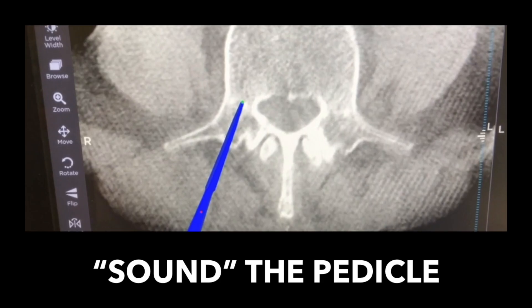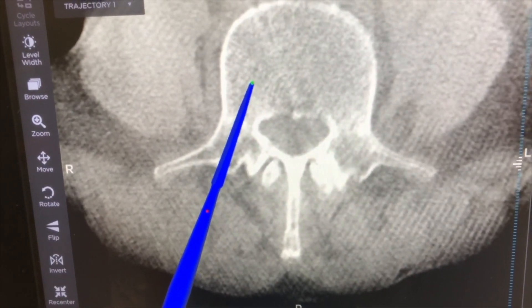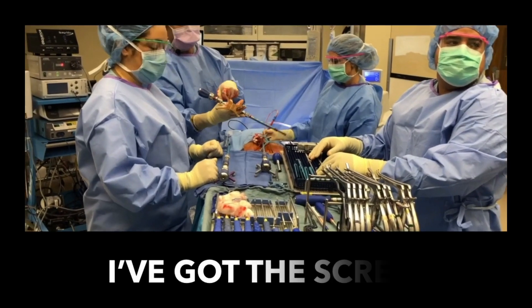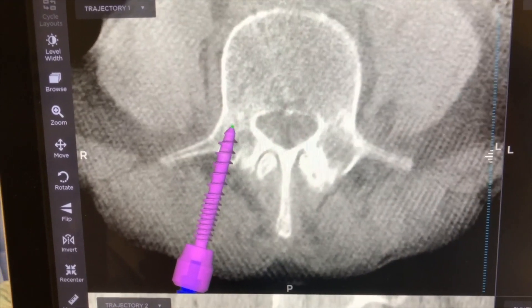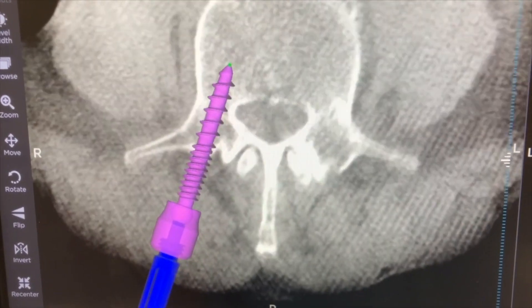Now I'm just going to let it pull me down. And I'm sure you know from open surgery you can feel this going down — it's like an invitation. Now I've got the screw on navigation. I can feel it pop into that little opening, and as I advance it, it should feel like it's pulling me down. Mostly I'm just letting it pull me down.